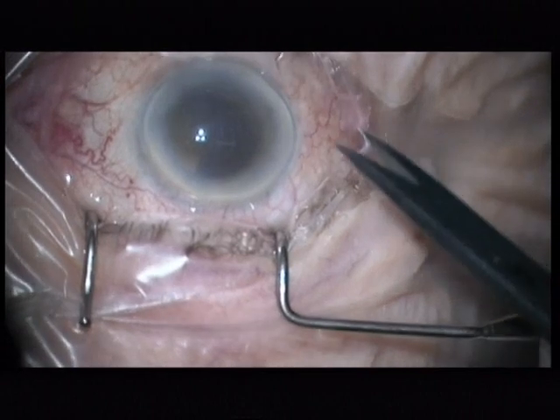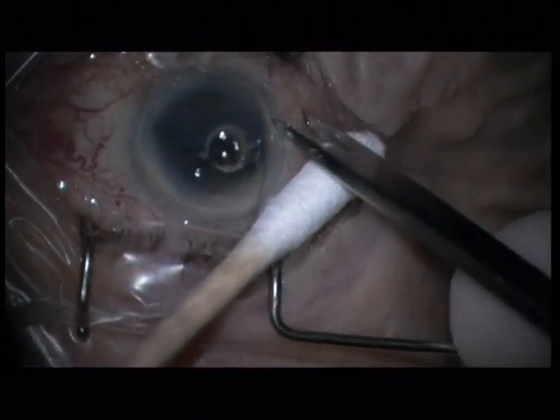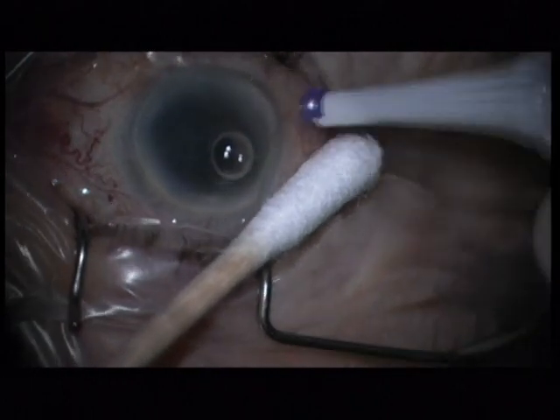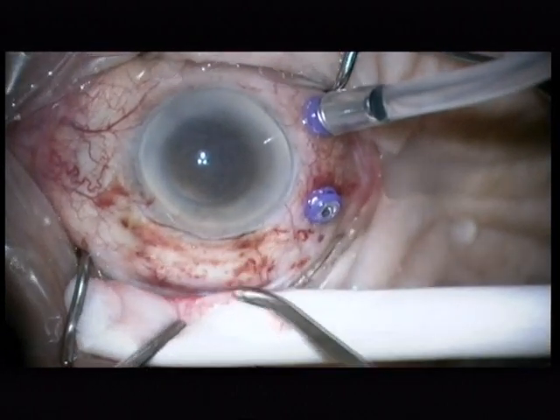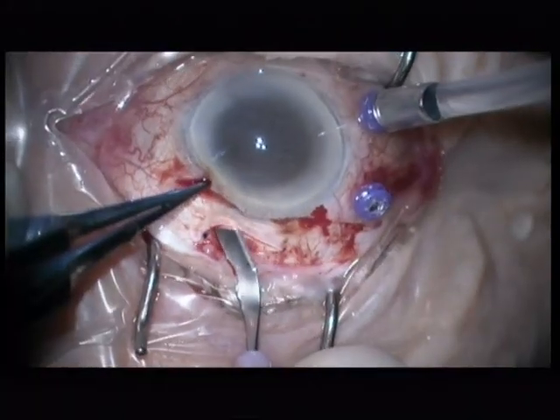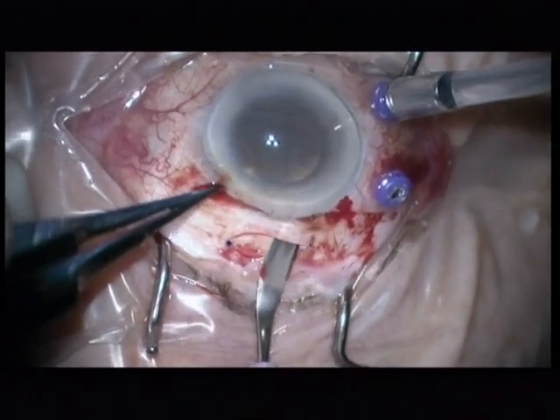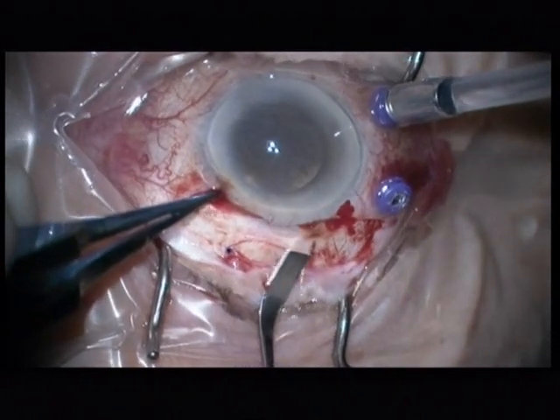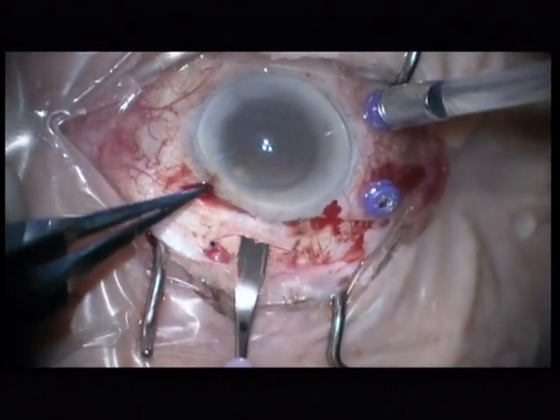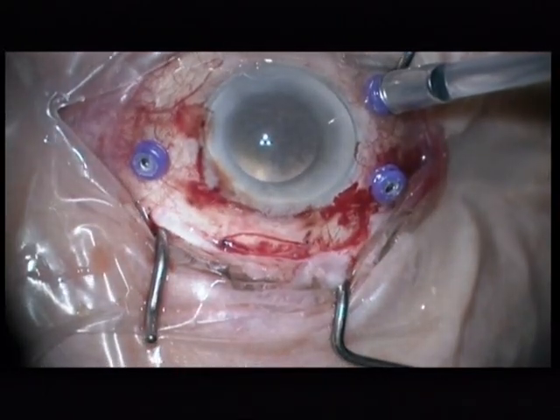This is the intraoperative finding. There is no more hypopyon present. I insert 27 gauge trocar cannulas. Next step is a scleral tunnel. I'm using a bevel up crescent knife. The scleral tunnel is 6 mm wide.